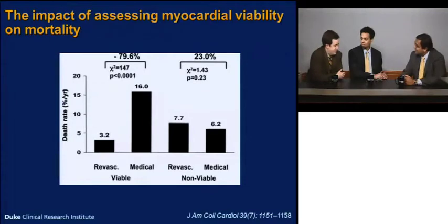No, I think that's exactly the challenge here. Times have changed, and the selection of patients in continuing studies is important. In this example, the techniques for viability have improved since this study was done. If you believe in that concept, there are still questions about that. Even doing the large trials to assess that takes many years, and during that time frame, the technology is also improving. So when you have an answer from a large trial like STITCH, which has some imaging component but not necessarily the viability that we're doing here, we're still left with other questions.